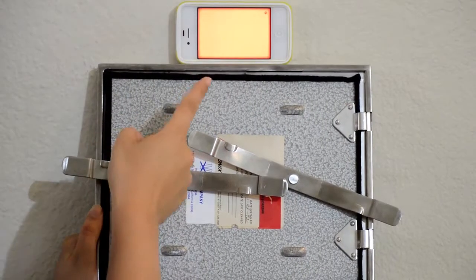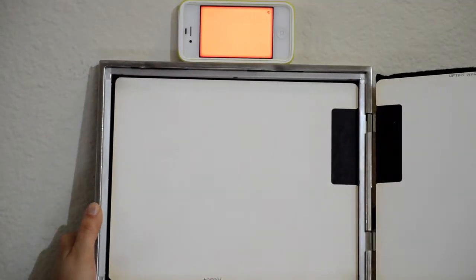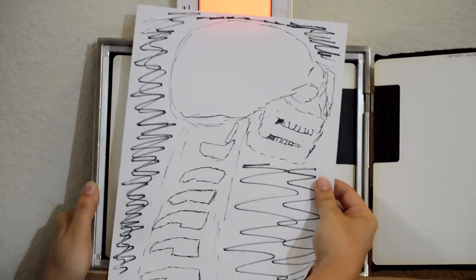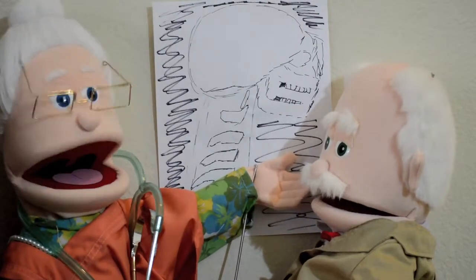I then turn on my red light filter, remove the film from the cassette, and put it through the developer. And after, I will then get my manifest image to use for diagnostic purposes. Now that I have my X-ray, I can proceed with chiropractic treatment.